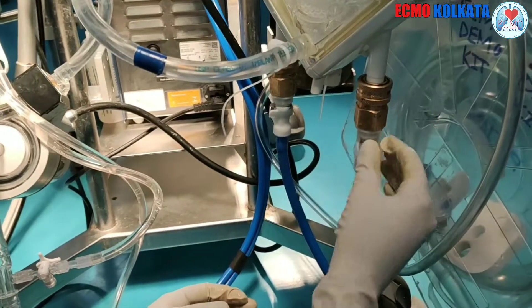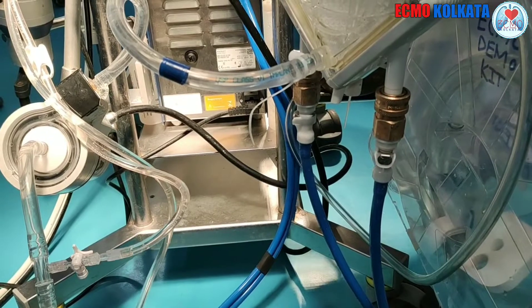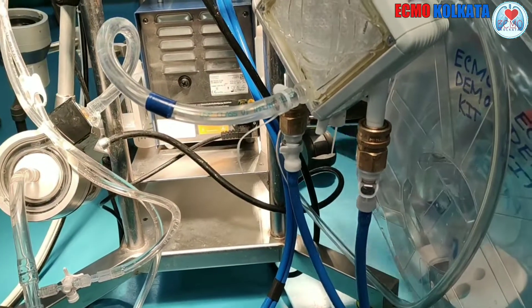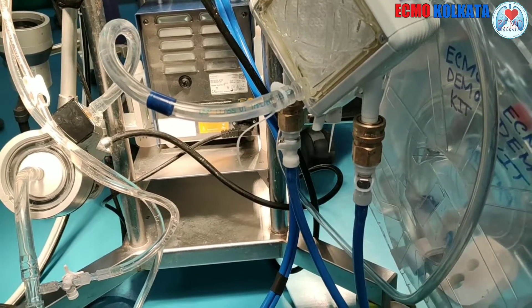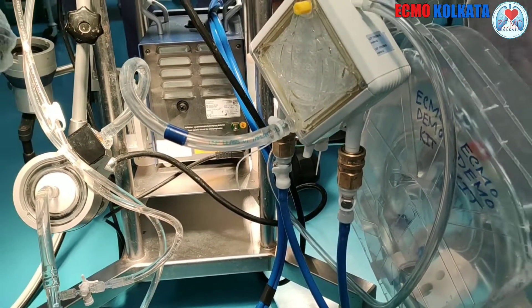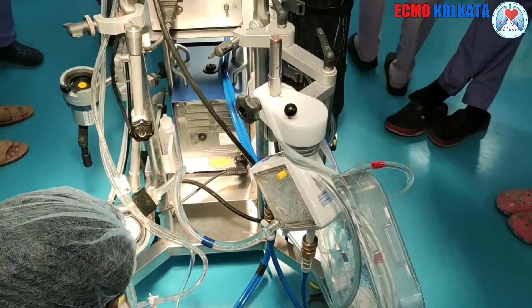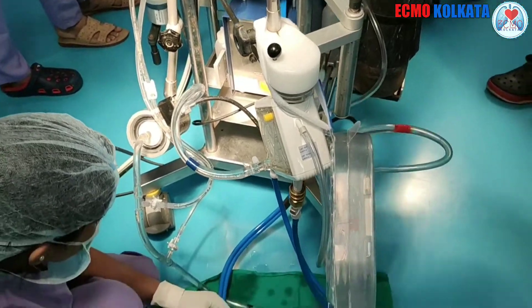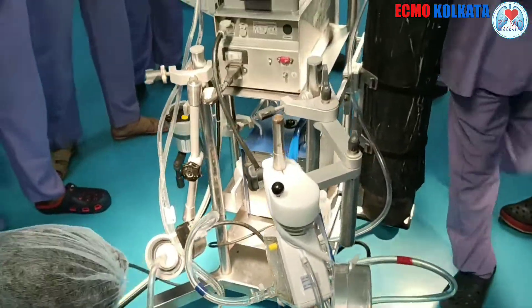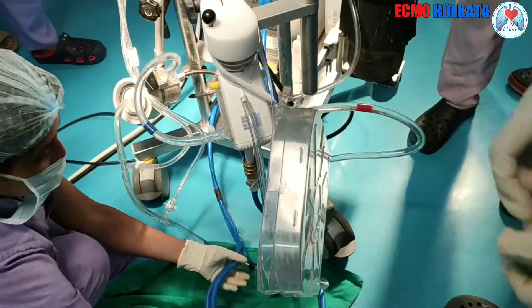The connection is established. Now we are ready for passing the line to the doctors who are cannulating. Finally, we check all the connections before passing the line. Now it is ready to pass the line to the doctors.